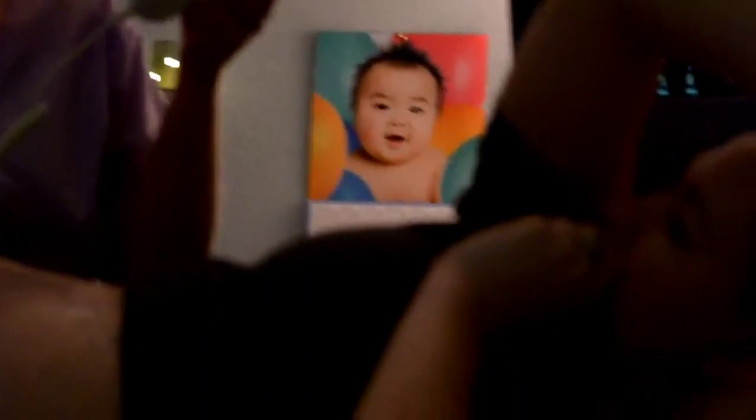She has hair. We can listen right there. She's trying to get a grip of her feet. Finalizing your DVD. The DVD is the video — it'll work with the DVD player or the computer. The CD has the pictures on it that you can take to Walmart to print or put on the computer. She's trying to get in there. There she is.